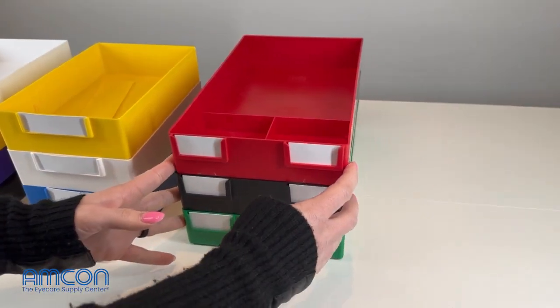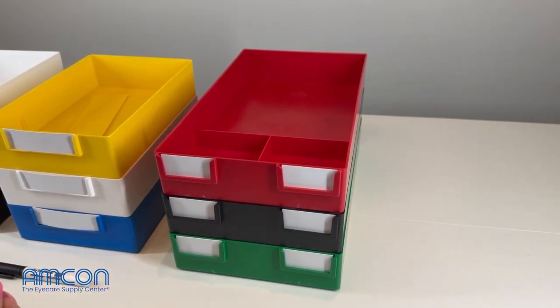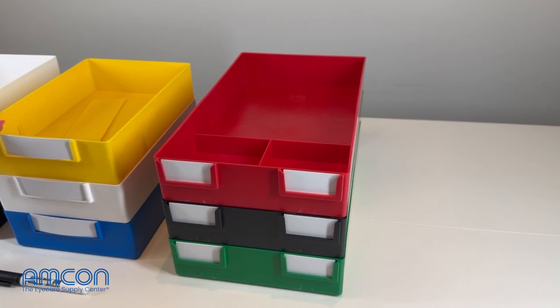Then we move over to our oversized job trays. These are going to be used more on the lab side of things, and they do not stack with the other two.